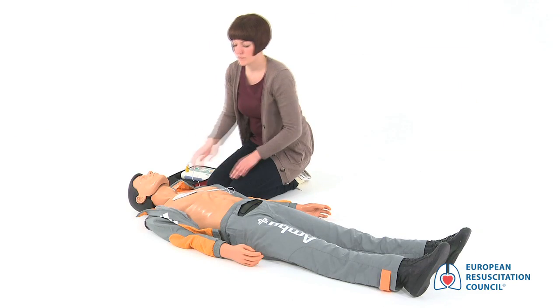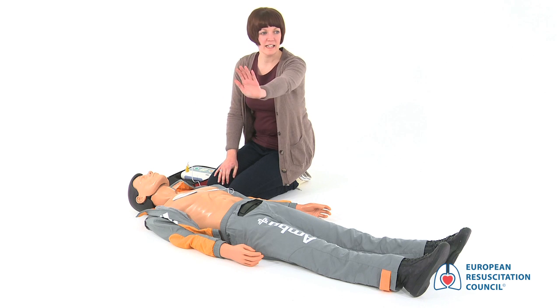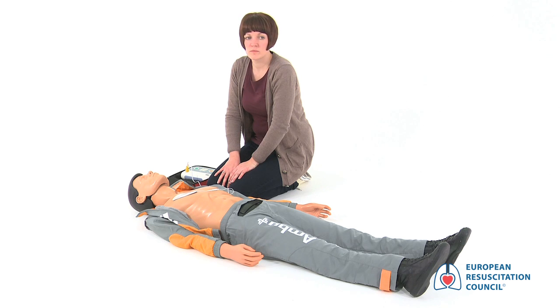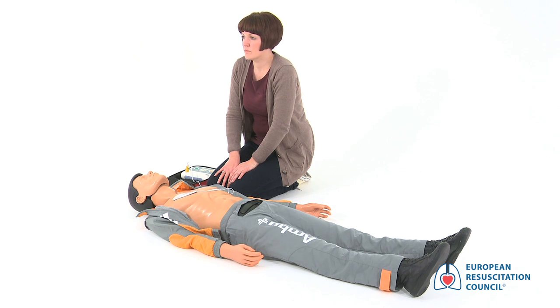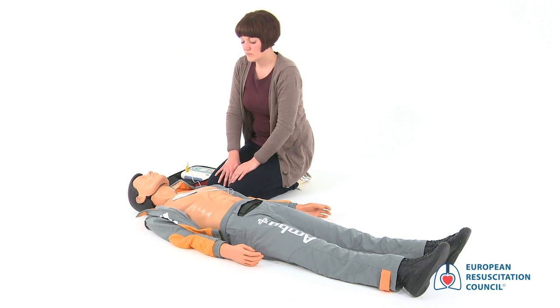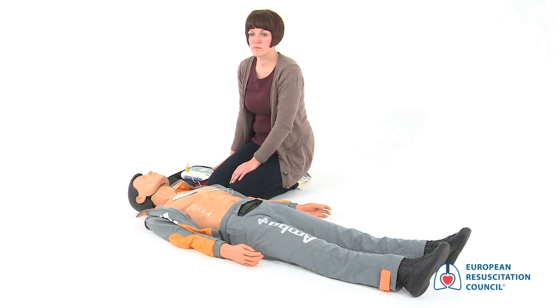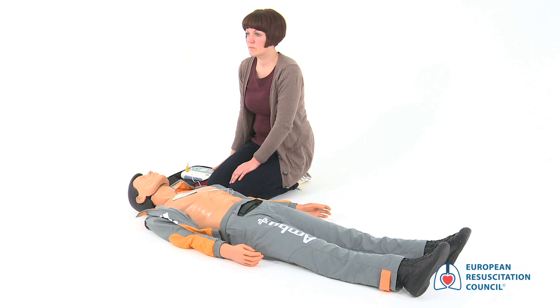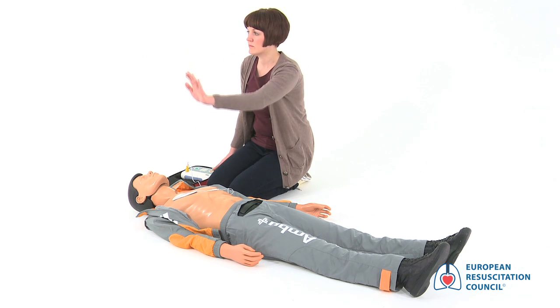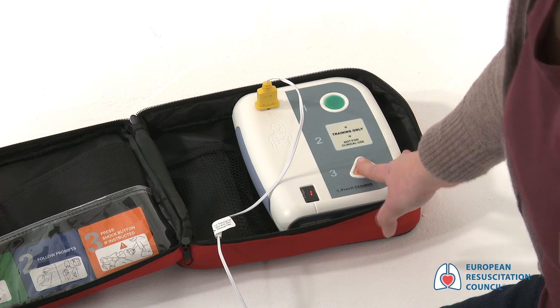Analyzing heart rhythm. Do not touch the patient. Stand clear. When prompted by the AED, look to see that everyone is clear and call stand clear. When prompted by the AED, press the shock button. Deliver shock now. Stand clear. Press the orange button now. Shock delivered.